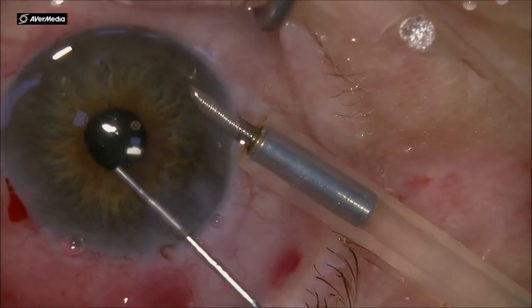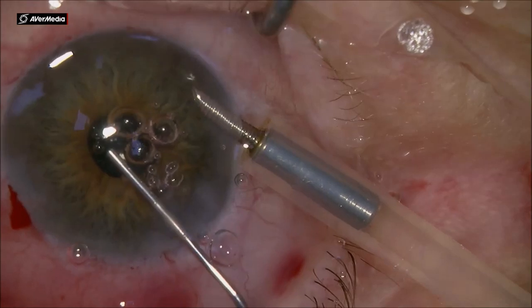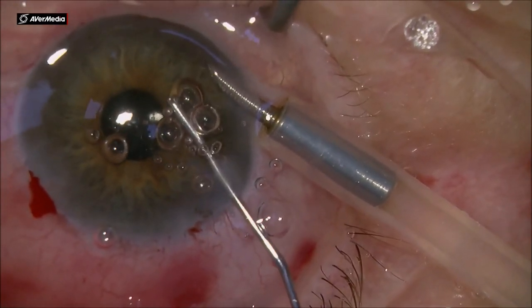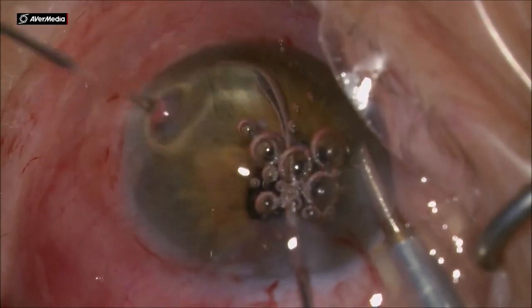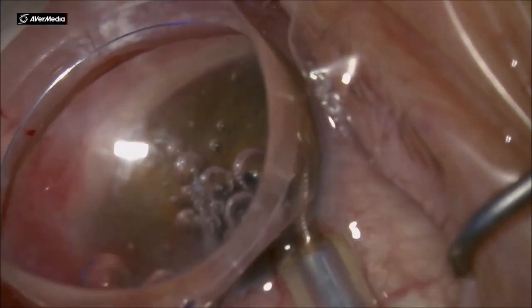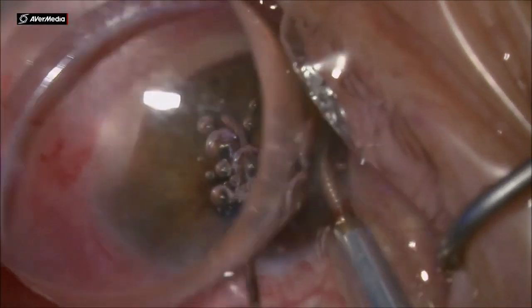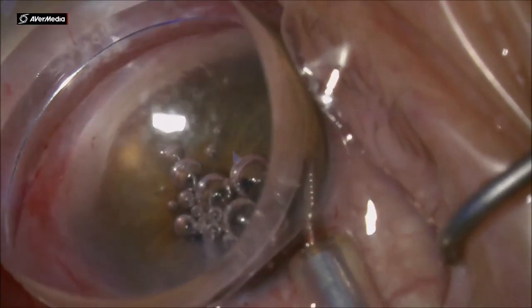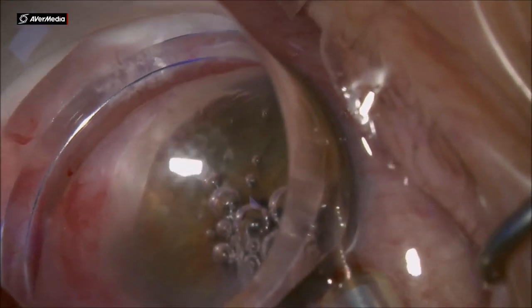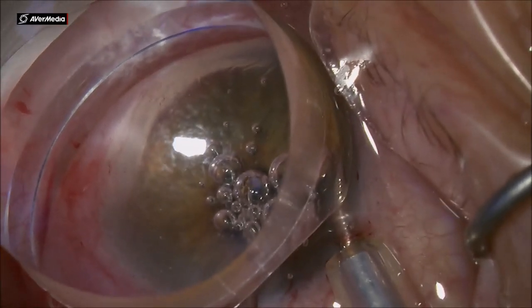Dear guys, this is another mixed procedure. After the cataract procedure, I'm placing the viscoelastic inside the anterior chamber and I'm trying to cut the trabecular meshwork using a bent angle needle goniotomy.